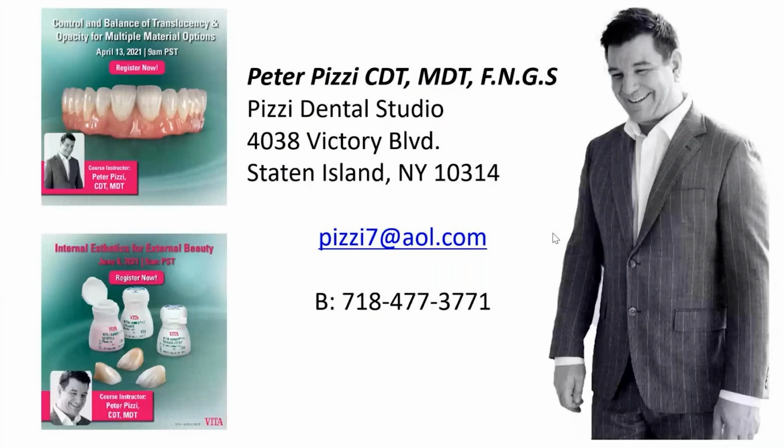I can, because I have power washes with the Lumex kit, but I'm not sure everybody has that in the kits they use. The other option that we do is we just try to thin the lithium disilicate as much as possible, and then use a flow dentin or something with a little more fluorescence around the cervical to help increase the light into the tissue.